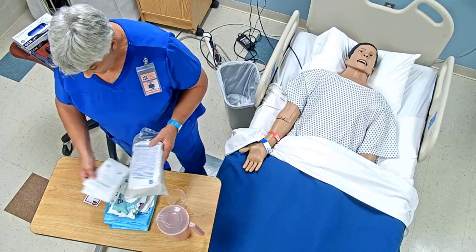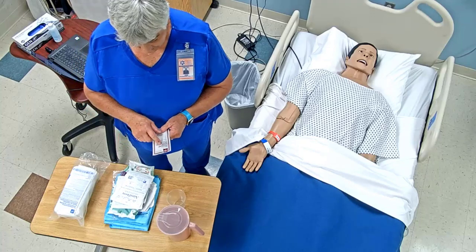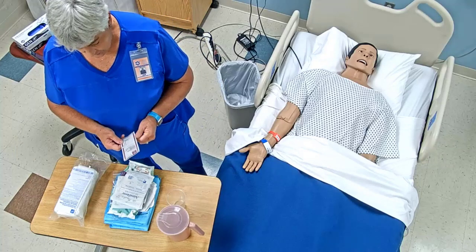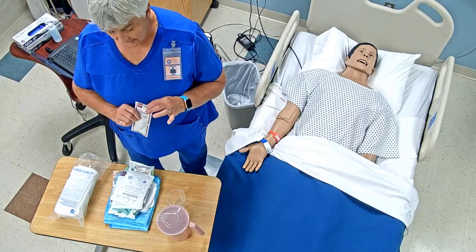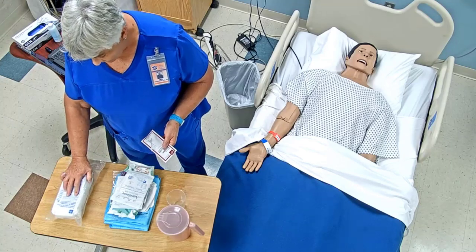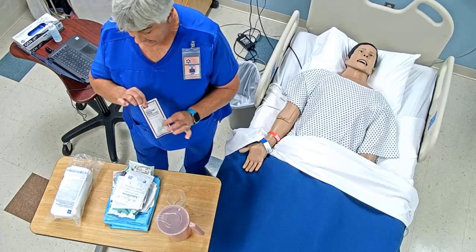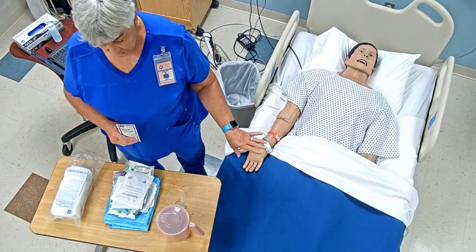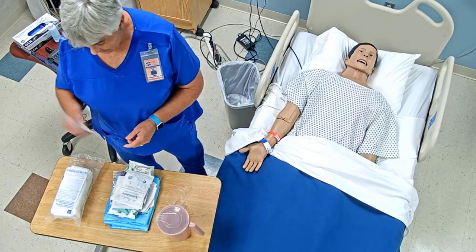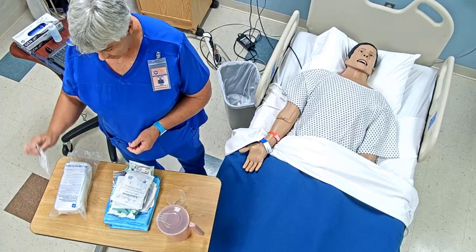Now, your kits will come with iodine betadine swabs in here, so you will need to go to your lab director and get those switched out. Your kit will be opened just enough for you to take out the swabs and put in the swabs that you can actually use on the mannequins, because you will be touching the mannequins with this. So just know you'll have to switch that out in your kits before you get started, okay?